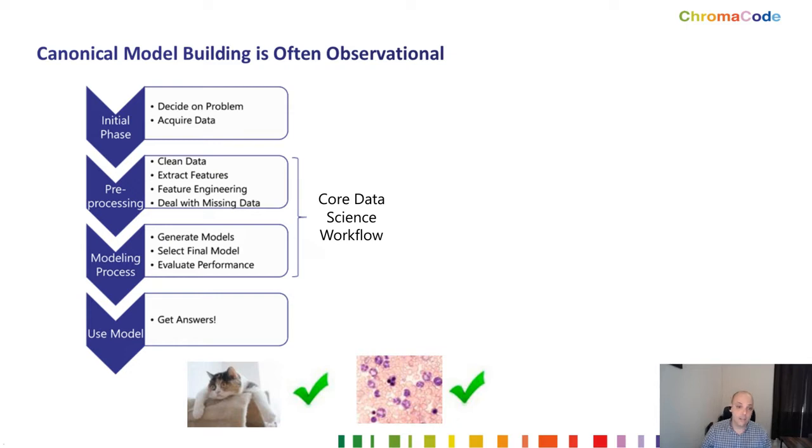The same idea you start with and then you put down into your pipeline. The next step is called pre-processing. This is where you clean the data. So you may have data that is useless. Maybe some of the slides are broken, maybe some of the images aren't really usable.